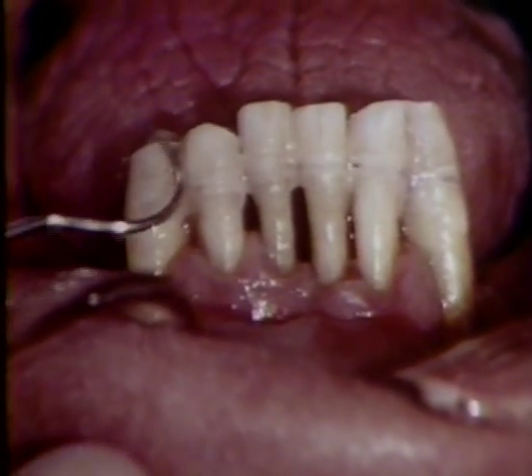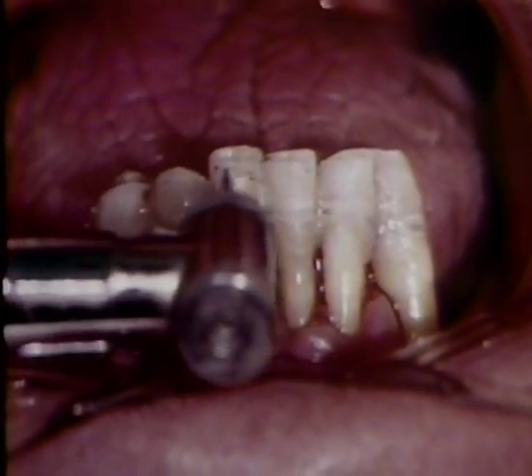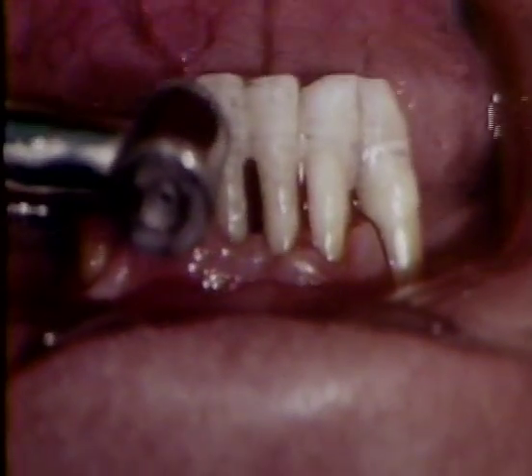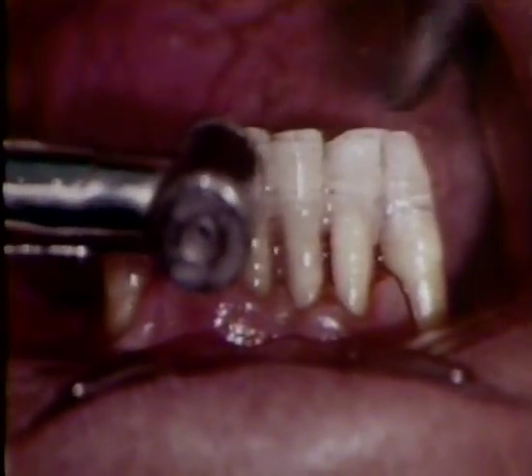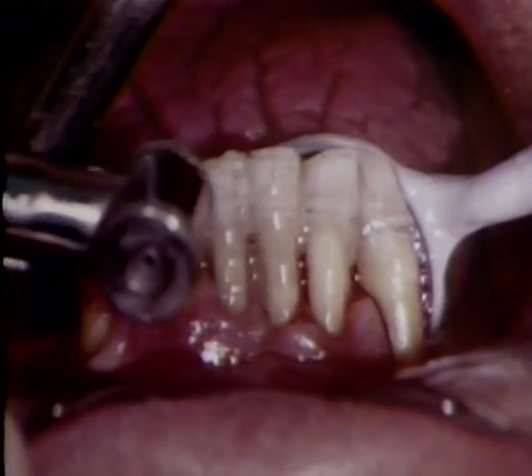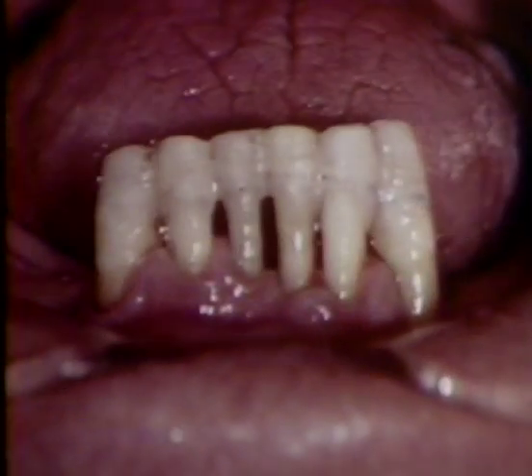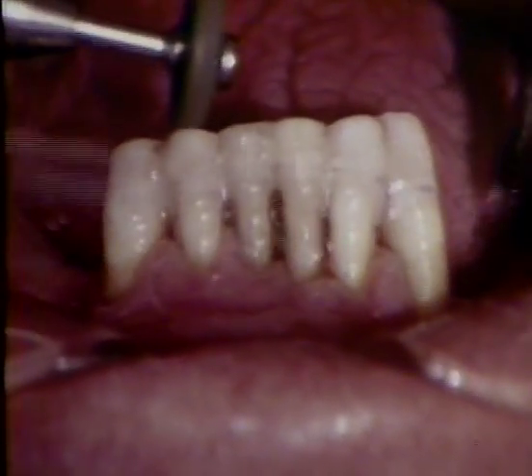At this time, it is desirable to reduce the overall length of the clinical crowns of these mandibular teeth. This is easily accomplished because sufficient natural pulpal recession has occurred. The reduction also reduces torque on the entire splint and improves the general aesthetics. The pumice wheel is again used to smooth the cut incisal surfaces.